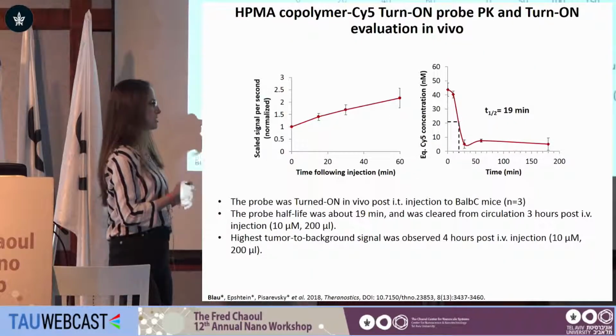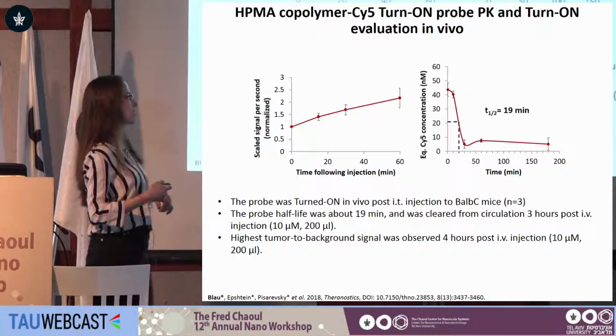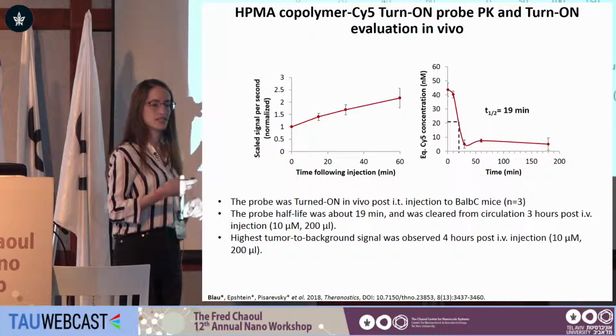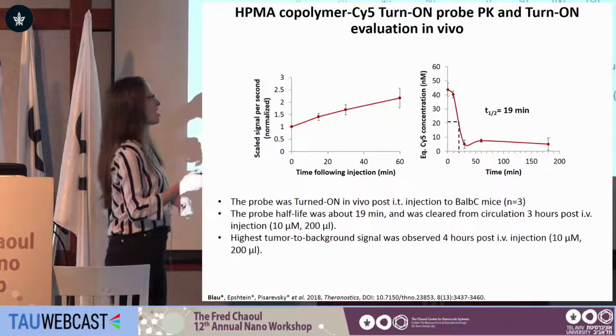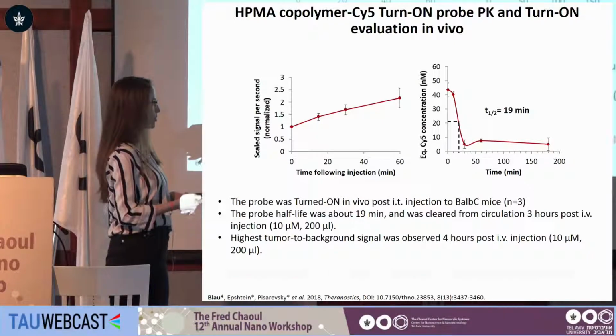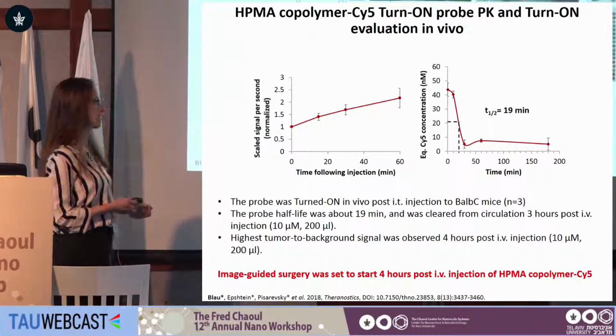So we proceeded with our turn-on polymeric system and revealed by pharmacokinetic studies a half-life of 19 minutes and clearance from the plasma almost completely after 3 hours. So we started the image-guided surgery accordingly 4 hours post-IV injection.